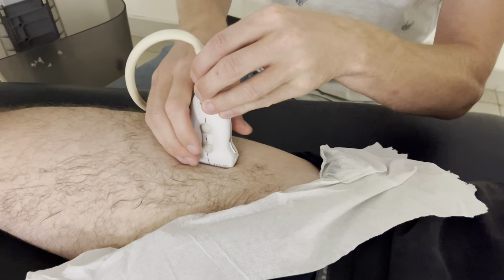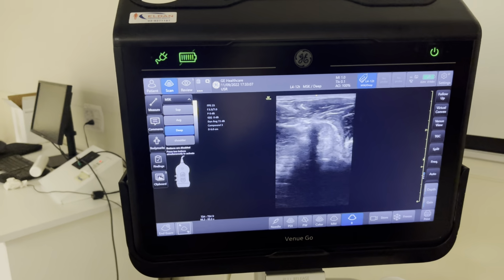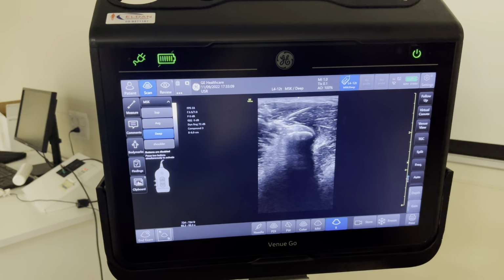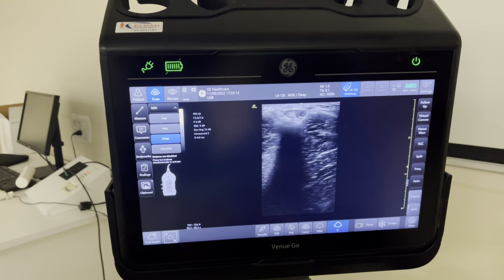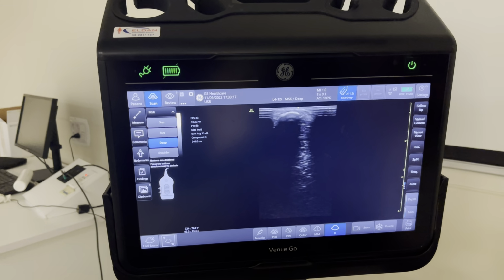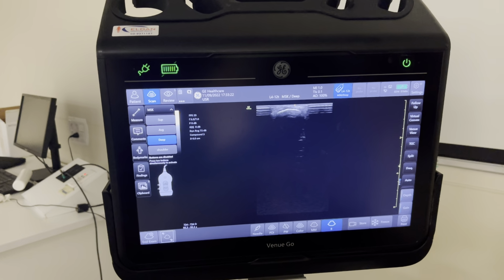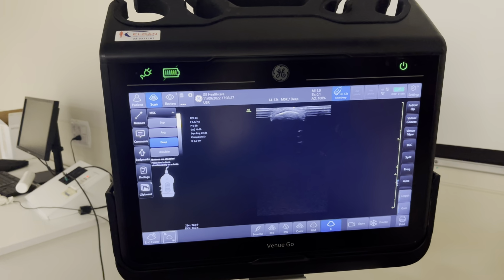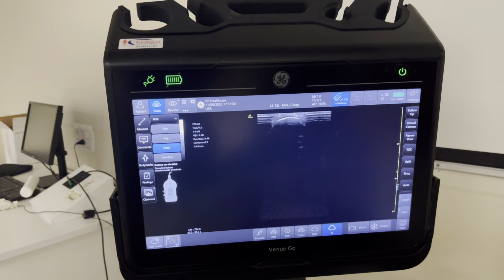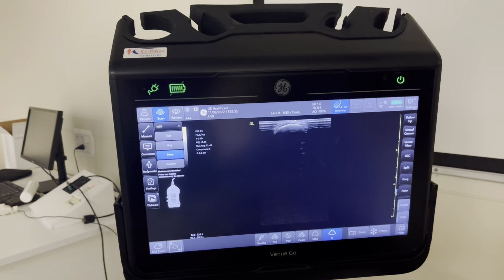We go back to short axis again. Follow the rectus. There we have the bony line with the acoustic shadowing. Now if we continue up, we end up on a very superficial hyperechoic bony line, which is the anterior superior iliac spine. And from there we have a short axis view of the Sartorius, which goes medially, and the Tensor fasciae latae, which goes lateral. We'll start with the Sartorius.